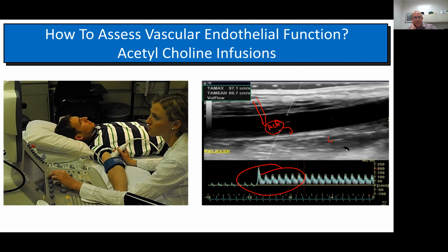As you can imagine, it's not a lot of fun to stick needles in people's arteries, especially big ones like the brachial artery or the femoral artery, heaven forbid, the aorta. So we don't like to do that very often, and we're not gonna do it here at BYU. They don't let us put needles in people's arteries. You need like an anesthesiologist to do that, okay? But the magnitude of dilation that happens, that's the gold standard. That's really how we know how healthy the arteries are.